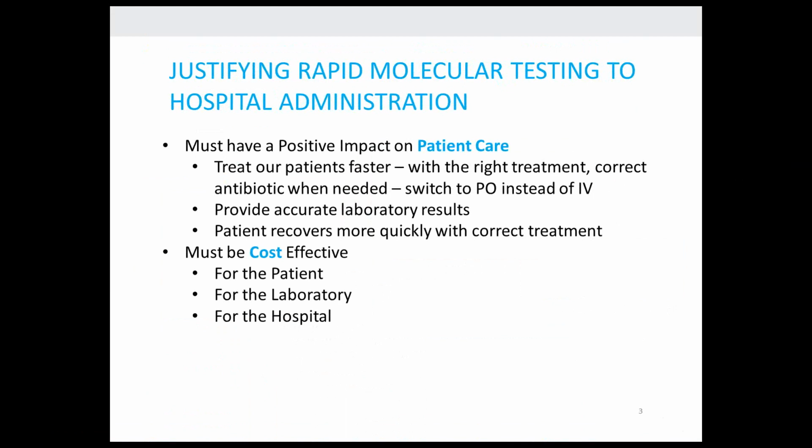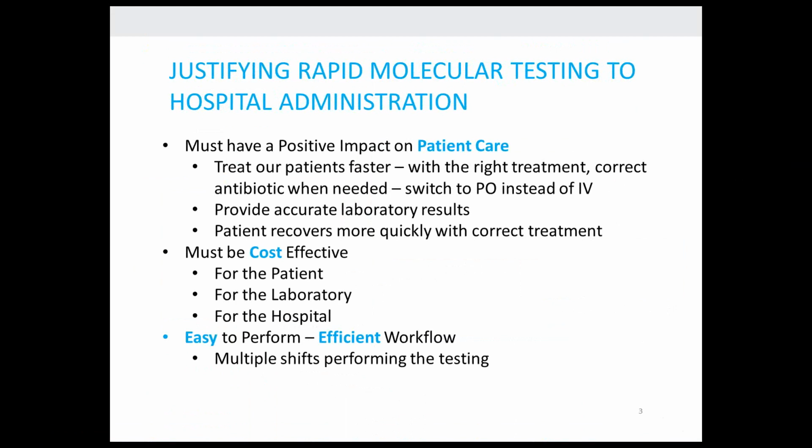So we wanted something cost effective for us and something that doesn't take a lot of hands-on time, because cultures or viral cultures, some of those things take a lot of hands-on time to get the information. Also, is it cost effective for the hospital overall? So those were some of the things that we are looking at.